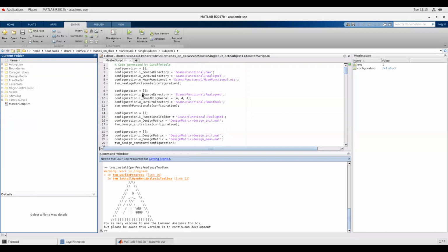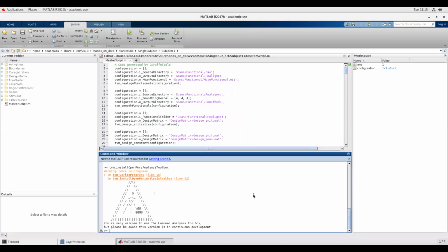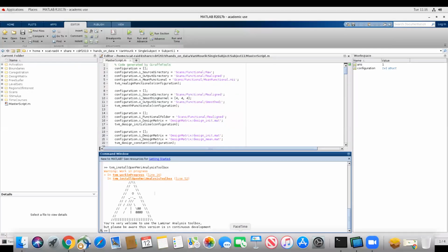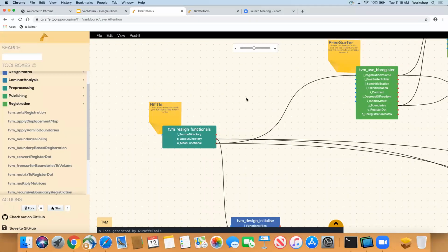Now, let's see. The script that we just built online. Sorry, can I move on again? Yeah, I think so. Let's see. How do I get my previous screen back? Where did my presentation go? Yeah, there we go. No, not Safari. There we go.